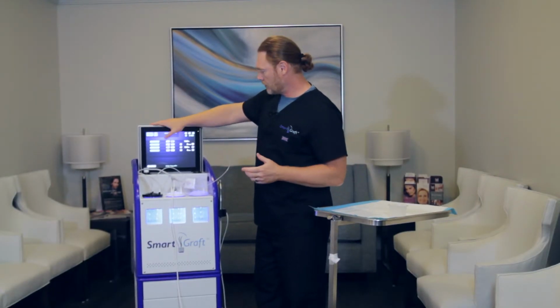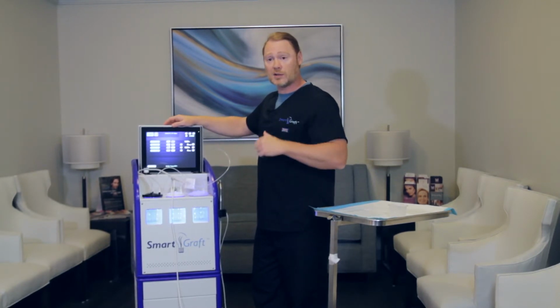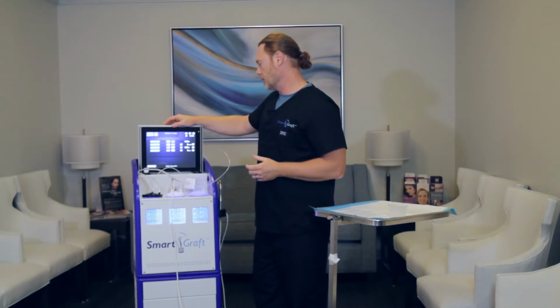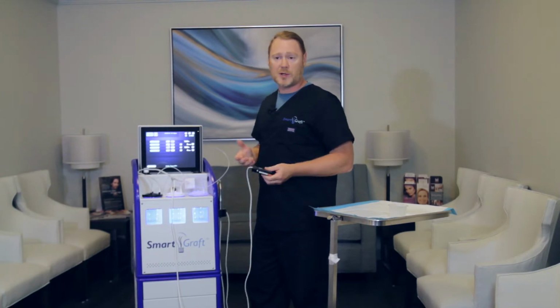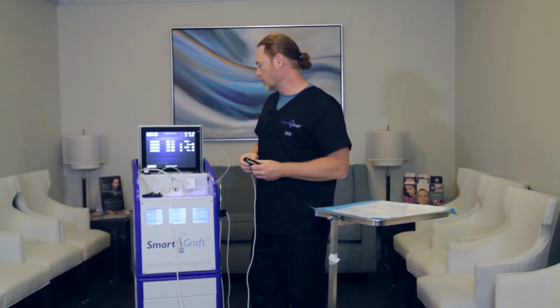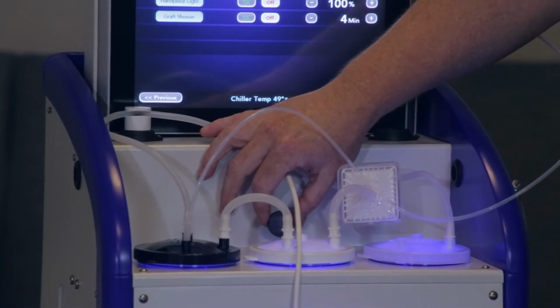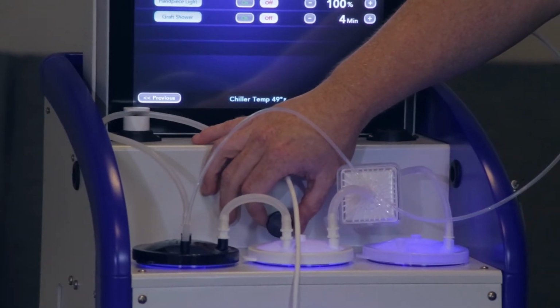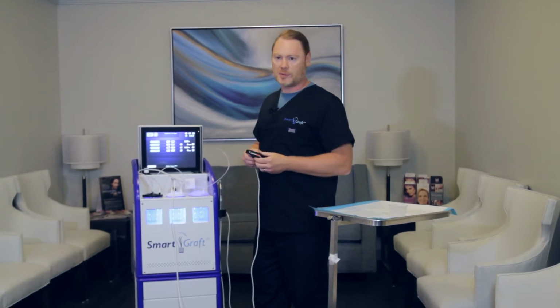The handpiece motor, you can turn that on. You can change the punch rotation to left to right for left-handers or right-handers. It's really your preference. In order to change the RPMs on the punch, because some people like it slower or faster, it's really going to be up to the operator's preference. You want to depress the foot pedal while using the knob to either turn it to the left to lower it or turn it to the right to increase the speed of the punch. Again, it's really going to be operator dependent.